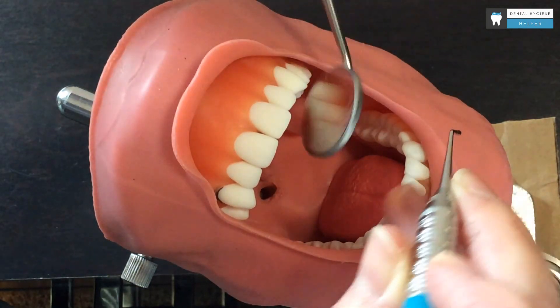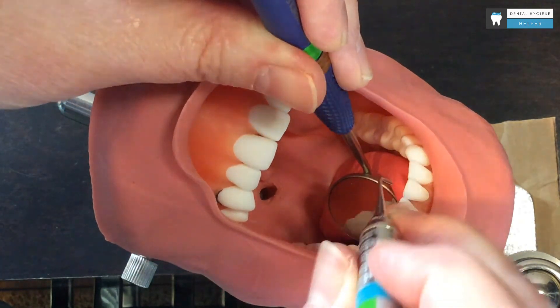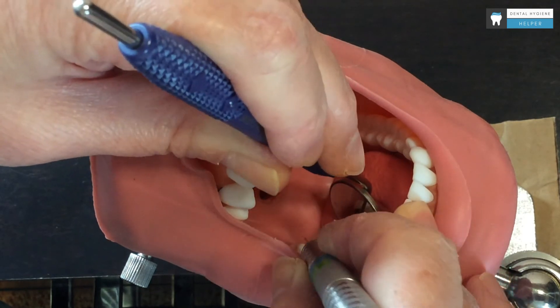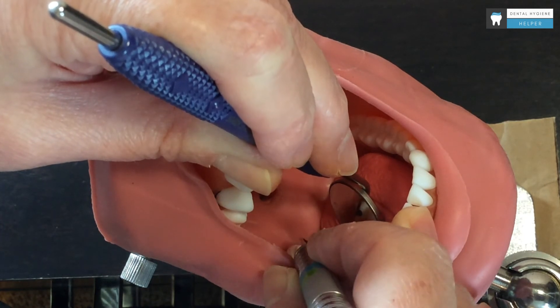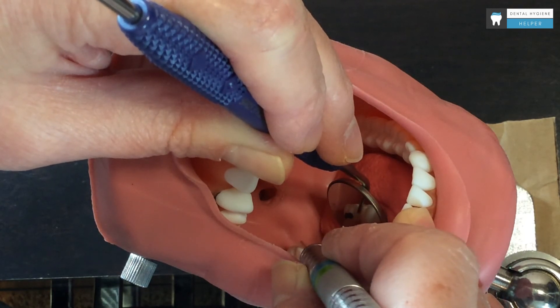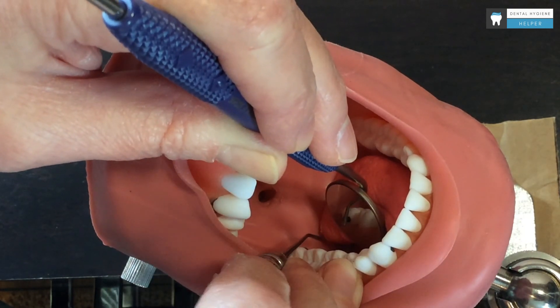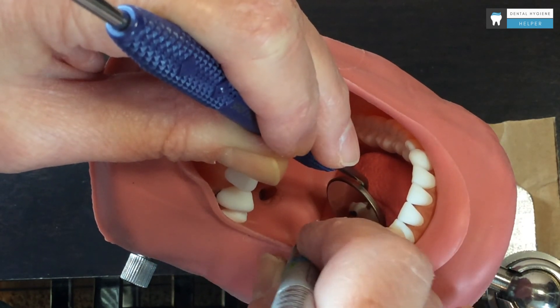From the same 11 o'clock position, I can retract the tongue and this time I'm using the mirror for indirect vision as well. I'm up on the incisals here and moving across again. As you move further back, you may need to not be as choked up on your instrument. Students sometimes wonder if they have enough control — it's going to really depend on what kind of stroke you are taking. If you need to remove a heavy deposit, you will need to be fulcrumed a little bit closer and may need to scooch in a little bit. If you're exploring or probing, it's okay to be a little bit further away.